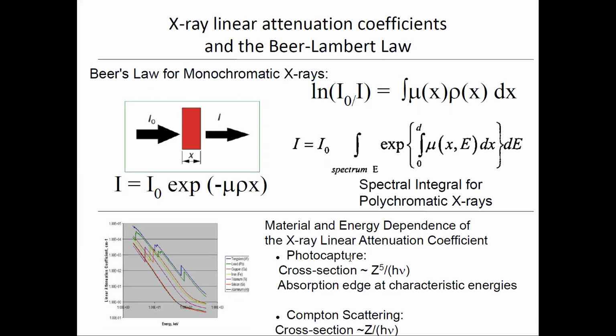You get your difference between your definition of your attenuation coefficient. So you need to watch out for scatters. If you presume the clean out of scatter beam means that there is no scatter, fine. Then you're going to have your absorption coefficient here, but you still are stuck with the fact that if you have a polychromatic source, which you do, then you're going to have different Radon transforms, as it were, for each one of these guys individually, each different spectral component.